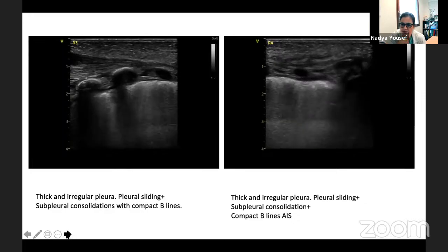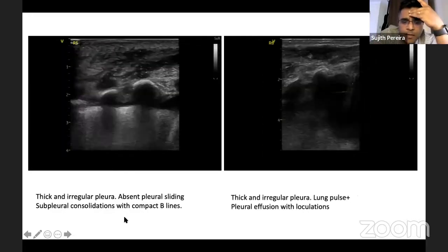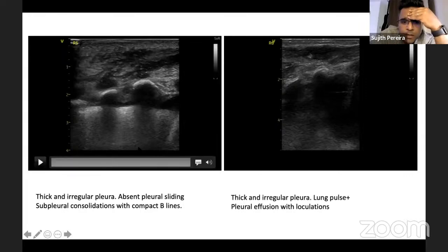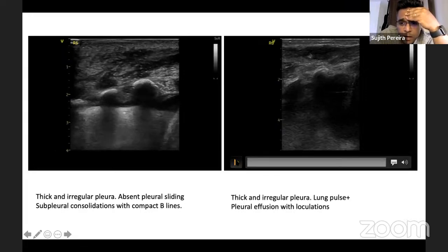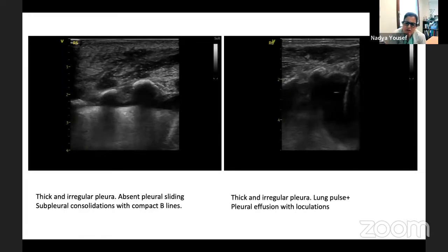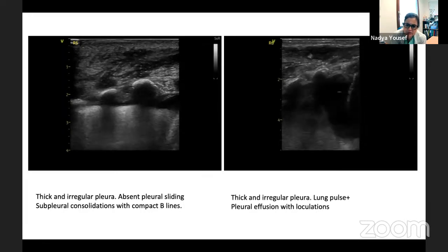And I'm not sure how that turned out once you treated the lung and increased the ventilation. So the baby is actually better, having been in about 40 to 60% oxygen when I did the scan over the weekend. Now the settings have come down, so we're in about 30% oxygen on a mean airway pressure of about 8 to 9. So there is some respiratory improvement clinically, but I have to say the lung pictures haven't changed very much. That's interesting, because they often precede the clinical improvement, or at least they go hand in hand with the clinical improvements.